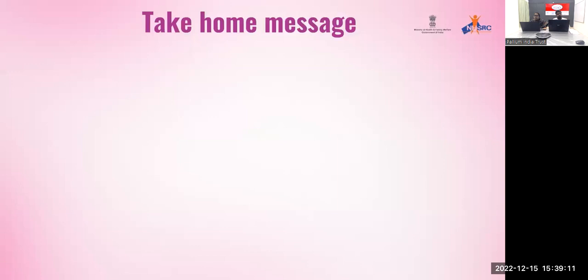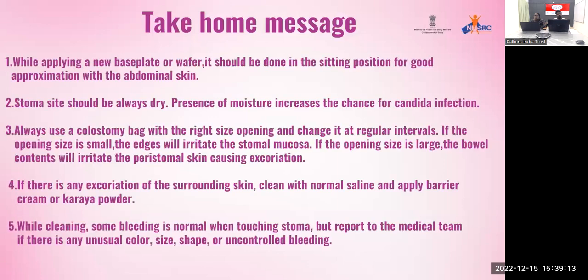Take-home message. While applying a new base plate or wafer, it should be done in the sitting position for good approximation with the abdominal skin. The stoma site should always be dry. Presence of moisture increases the chances for candida infection. Always use a colostomy bag with the right size opening and change it at regular intervals.